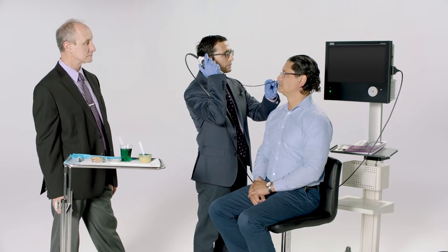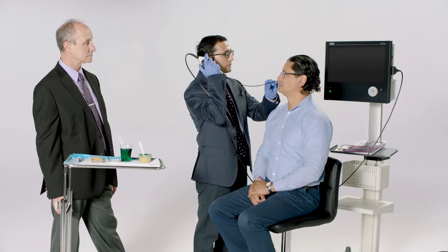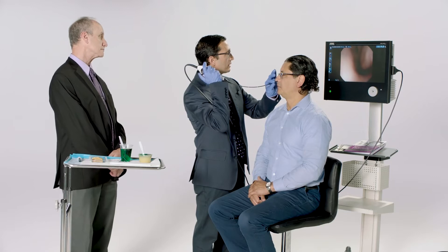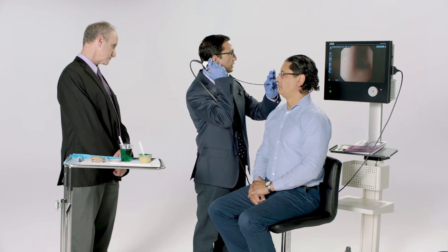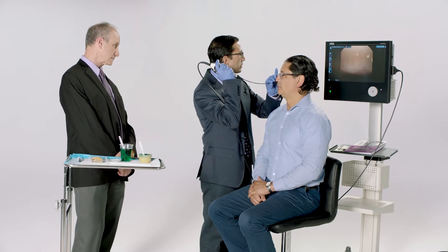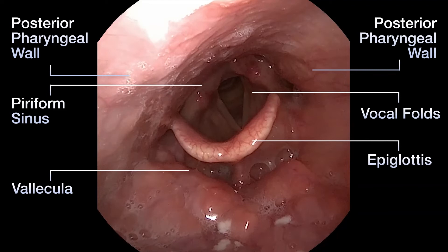After the food is adequately prepared, we are ready to perform the endoscopy. We always want to make sure the patient is comfortable. I typically look at both nasal cavities to see which one is more open for the endoscope — in this case we've chosen the left side. I'm inserting the scope through the floor of the nose towards the nasopharynx, and then passing into the junction of the oropharynx and the nasopharynx.